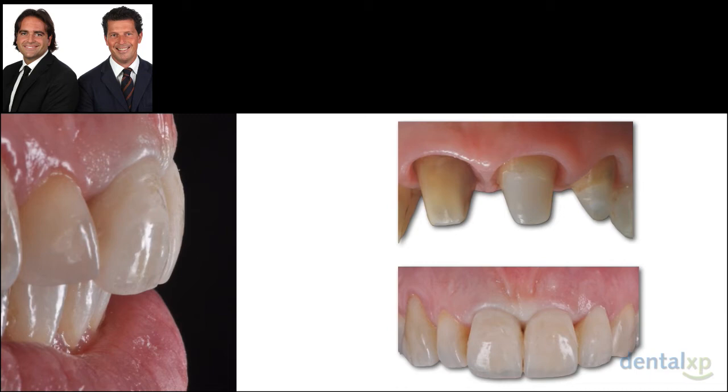We can now place again our temporary, and of course you see here ischemic tissue, and you see that we are doing exactly the same as the previous case. We are prosthetically managing the soft tissues.